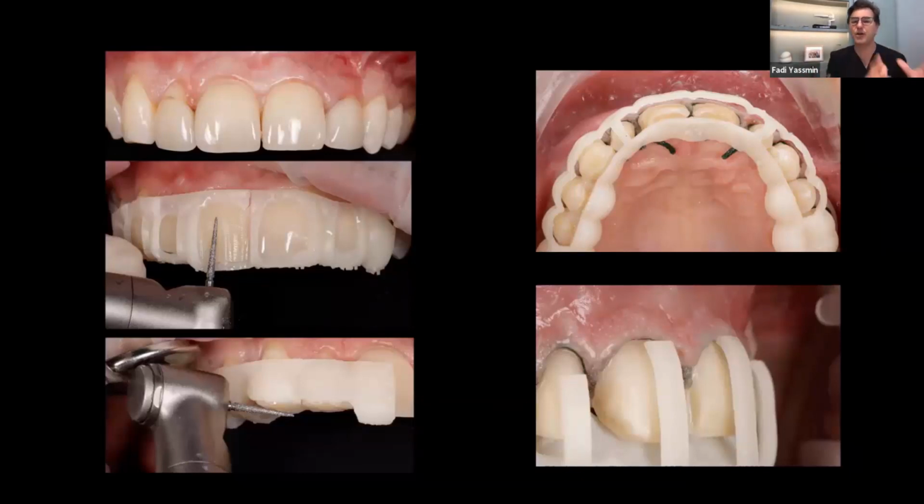then I do the motivational mock-up. From there, I say, okay, I'm happy with what I designed. Sometimes there's a tweak. I might modify the design because something you see in the mouth you think you can improve, or there's a comment from the patient. That's the beauty of a trial smile, and the beauty of being able to test drive. And then we'll say, moving on.